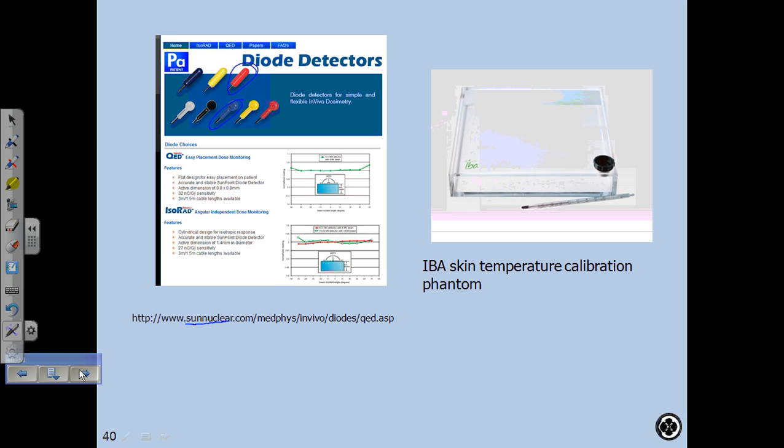So there's no standard temperature correction equation? No, because with chambers, we know that it's proportional to that equation that we use, that KTP equation. As temperature goes up and down, we can just put it in there, and that'll work. It's linear, in other words, with that equation. With diodes, we don't know the linearity, and certain diodes may exhibit certain response for a certain change in temperature, and others the response will change. So the recommendation is that whatever diode you buy, you calibrate it at body temperature.